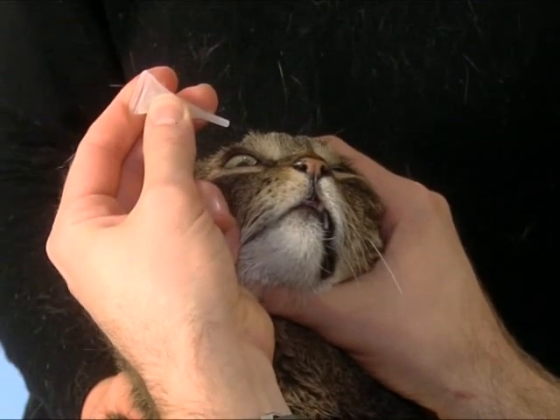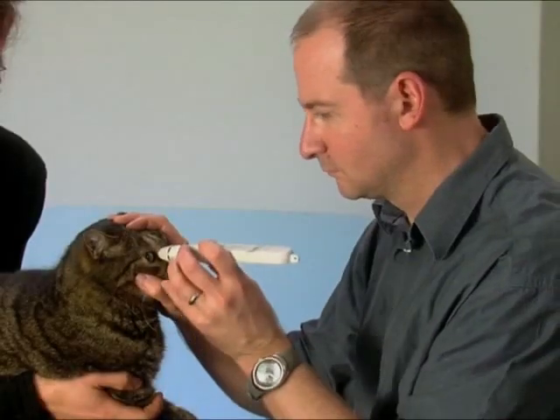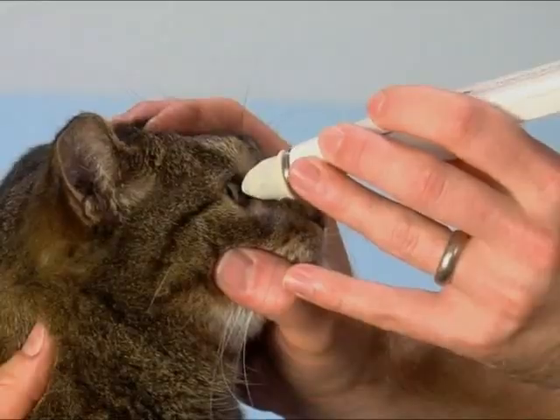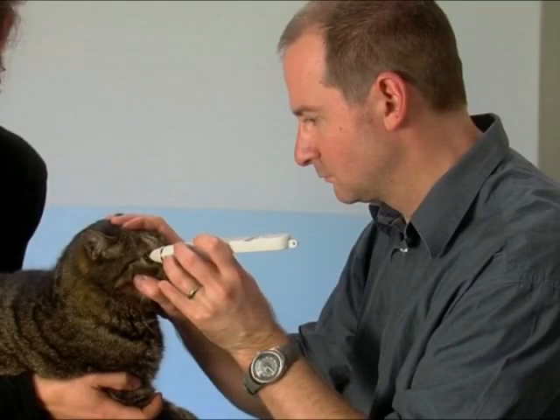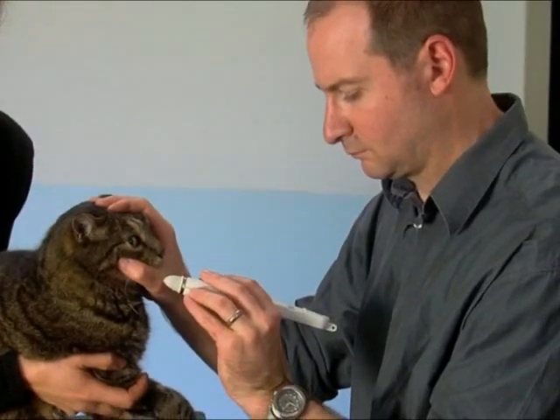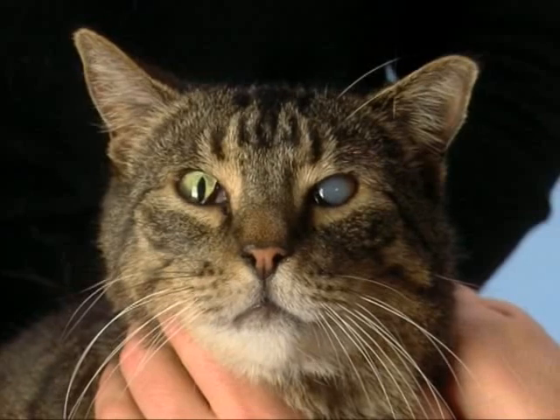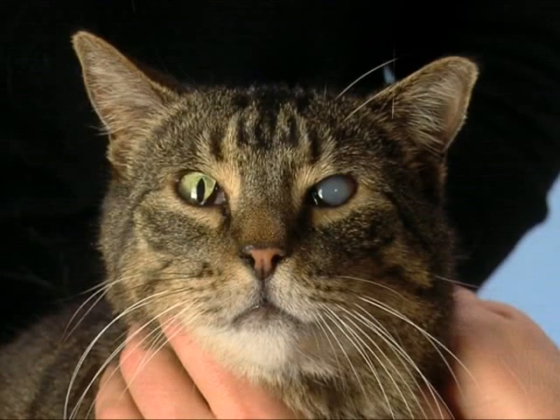Chronic uveitis is an important cause of secondary glaucoma in cats, so tonometry is indicated for monitoring of intraocular pressure. As feline uveitis is often associated with systemic viral infection, serology may also be informative. This cat was seropositive for feline immunodeficiency virus.